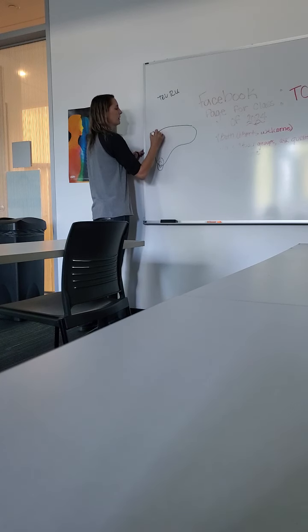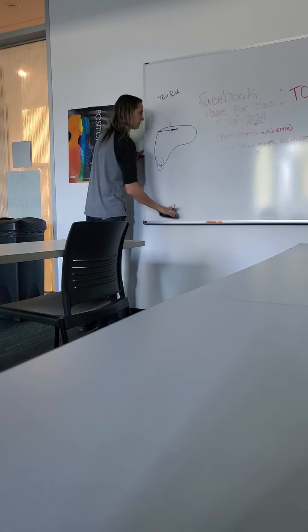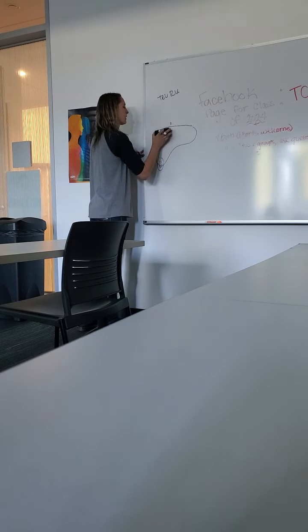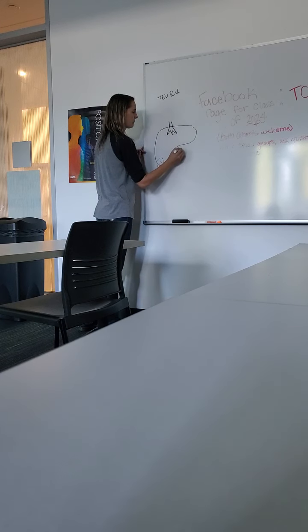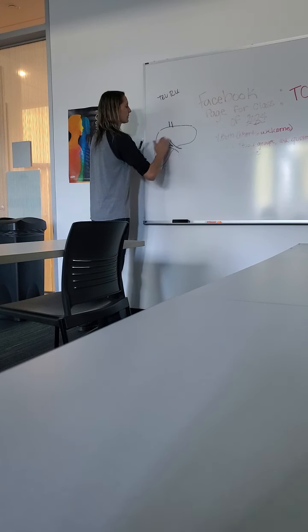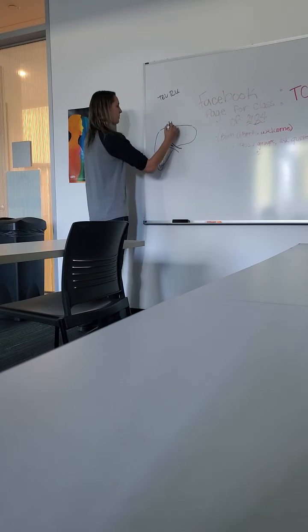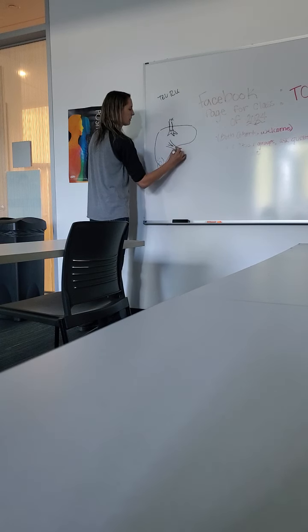So we're going to take one at the level of the dome. Maybe let me draw a few more landmarks for you here. So IVC. And we've got that porta hepatis with our main portal vein coming through. And we've got our kidney. Okay, let me revise this just a second. So IVC, hepatic veins, MPV, RK.